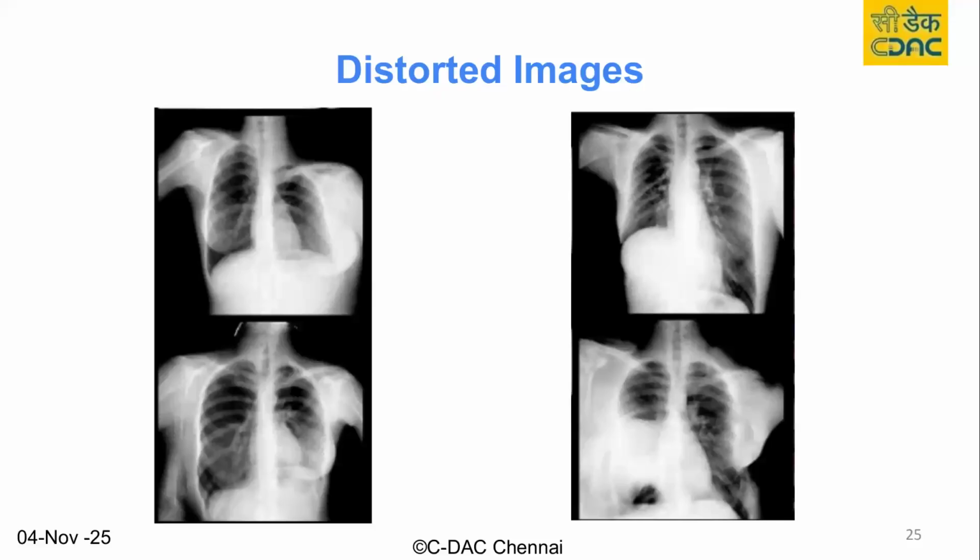And for distorted images, maybe if the person has moved when the X-ray image is taken, then you will get a distorted image. These kinds of images should be rejected when you upload the image itself. Otherwise the AI engine will give a faulty output. So it is recommended to remove these distorted images as well.